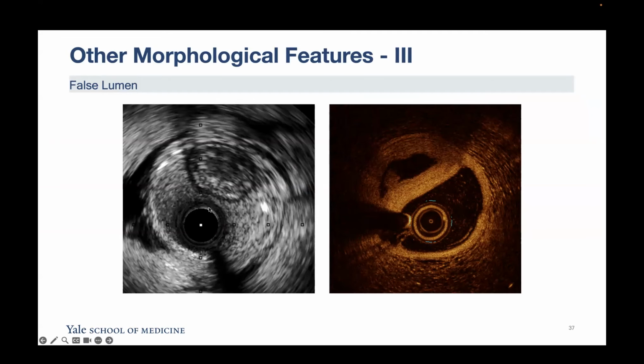So my catheter is here on the outside. The true lumen is actually collapsed here. We have the medial layer here. We have the true lumen inside. So I was extraluminal. So it was good for me to recognize that and not stand outside the lumen.